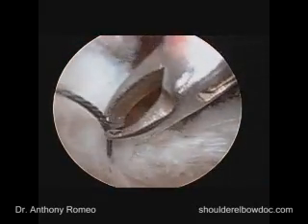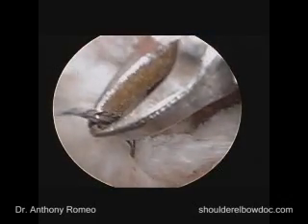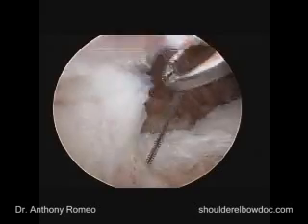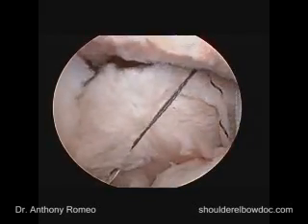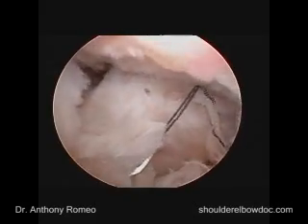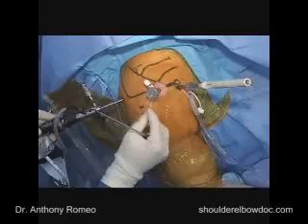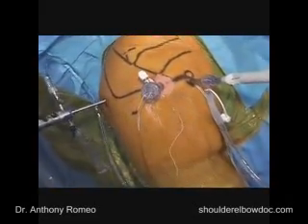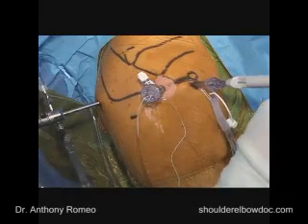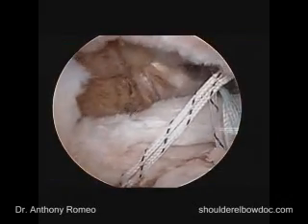There are a couple of different ways to do this. We can use either a crochet hook or a suture grabbing device. This is the more typical way that most people like to use to grab the wire loop. As we already did, we set ourselves up by having the suture out of the cannula. So we just pull the wire loop out, and then we can pass our suture through the loop that's created, and then pull back on the wire to make sure that it's capturing it well. We can see inside that it is, and then we'll just advance this on out.